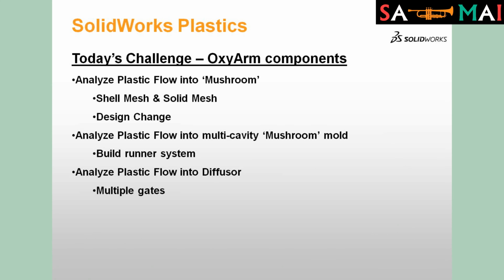Today's challenge, we have a component called an oxyarm. This is a medical device. If you've ever seen any of our other CAE specialists do a demonstration of our CFD software, SolidWorks Flow Simulation, you might have seen this. But basically what we're going to do today is take a look at a couple of different components in this design that are injection molded.